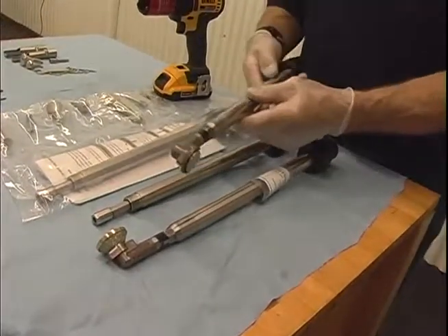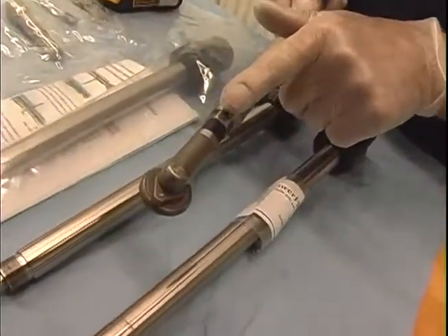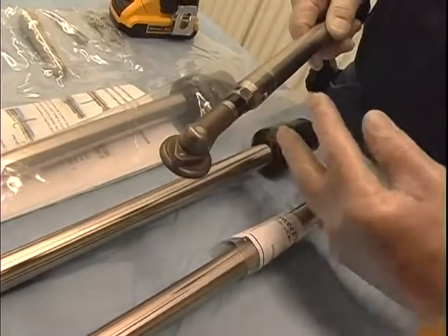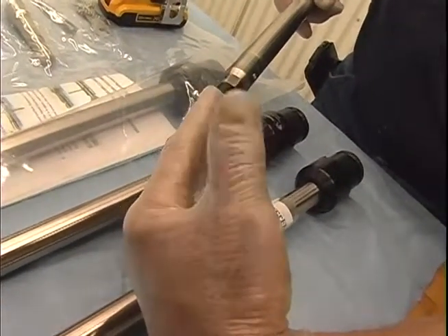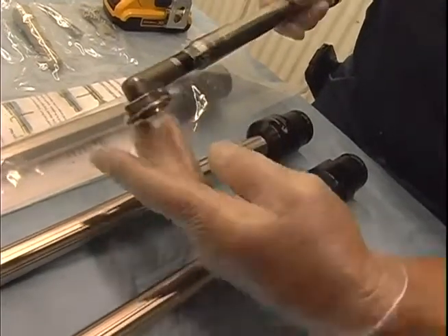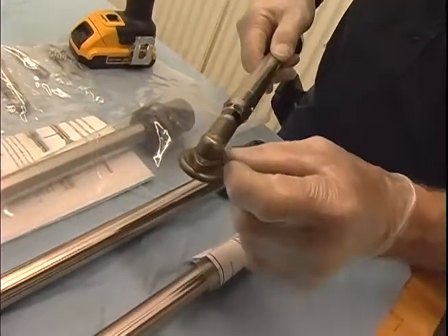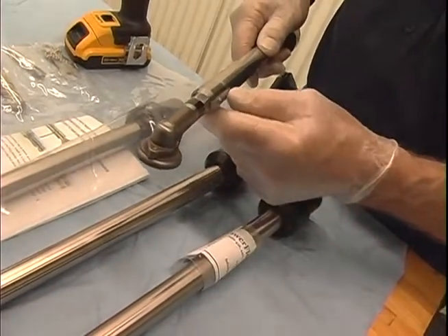One of the important features of the guarded right angle is that it has a very narrow shaft, so that when you're trying to get into the back of the mouth, you can tilt the right angle past the opposing arcade and slip in sideways and get into a very small area in the back of the mouth because of this narrow right angle tool. There's a little butt bar on the end to push mucosa back when dealing with the last upper tooth.